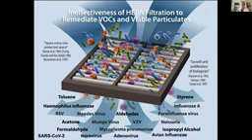As Jacques mentioned, VOCs are not captured by the HEPA filter. And just given our current status, hopefully coming out on the far side of this with the pandemic, SARS-CoV-2 has a very similar aerodiameter to the influenza virus. It's about 0.2 microns. Your HEPA filter is rated to capture particulates 0.3 microns or greater at 99.999%. So a lot of your smaller viruses are not going to be 100% captured by the HEPA filtration.